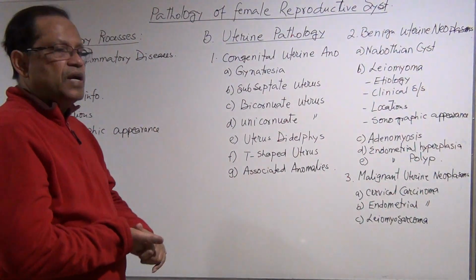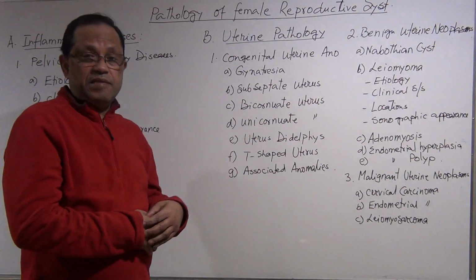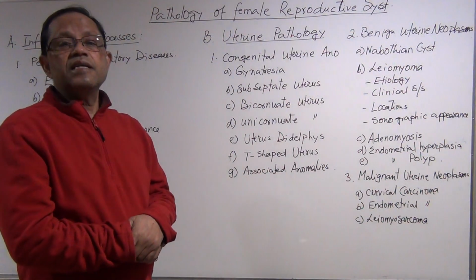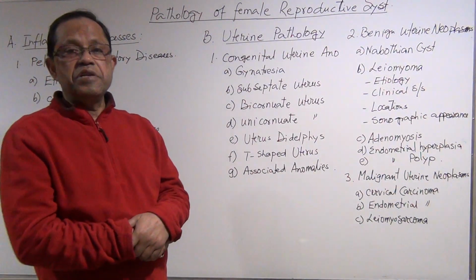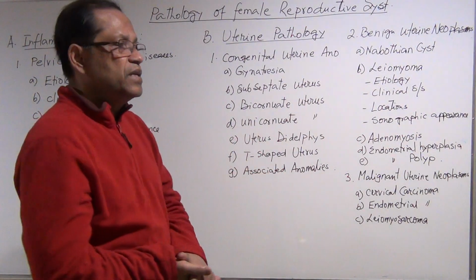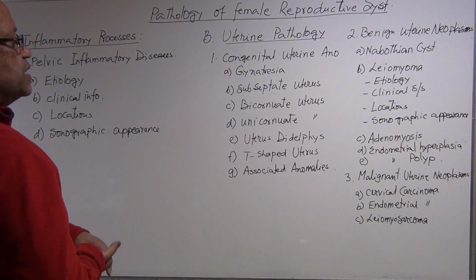In addition to ultrasonography, the patient may need other modalities: plain X-ray, CT, MRI, arteriography, nuclear medicine tests. So many types of modalities can be used for diagnosis of the disease.